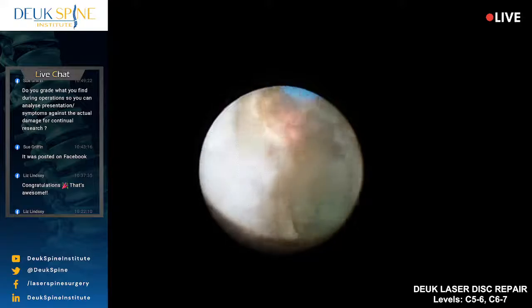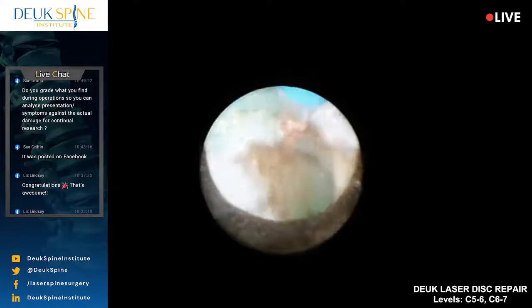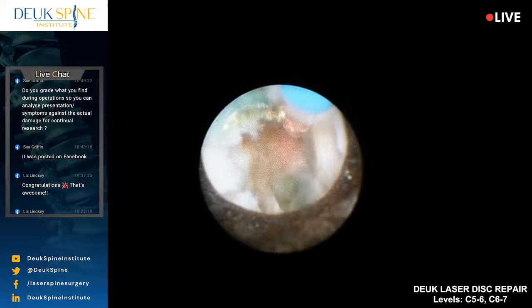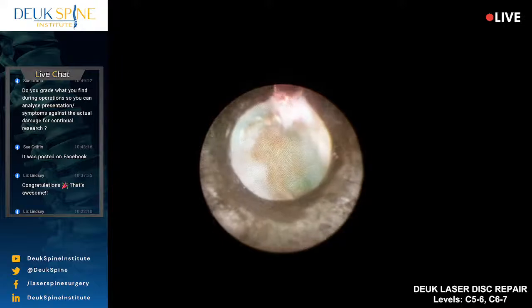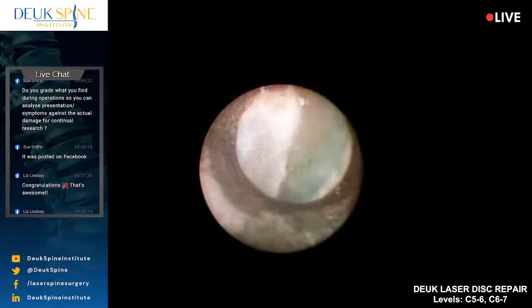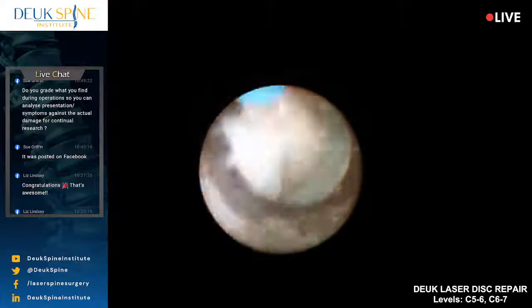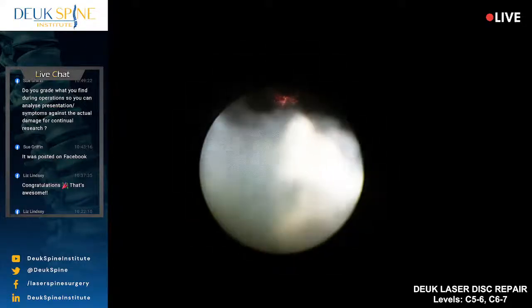And just to give you an idea, for those of you who don't know, the differences between what I do and what the South Koreans do. I learned the approach from the South Koreans. The approach means the needle, the guide wire, the dilator, all that stuff the Koreans taught me. However, the technique of debridement of the annular tear is my technique.